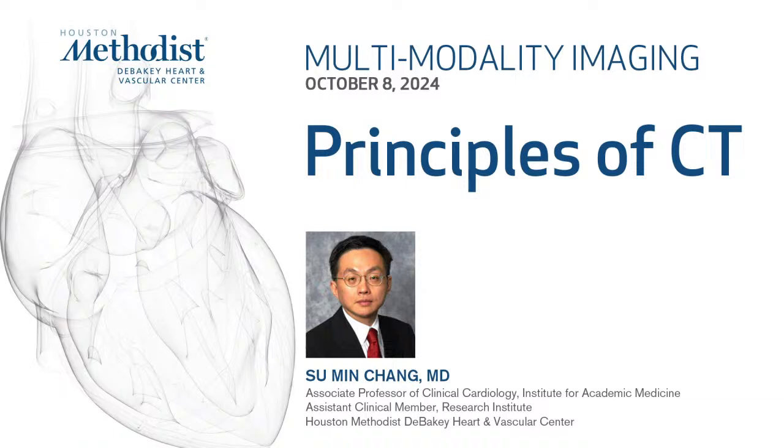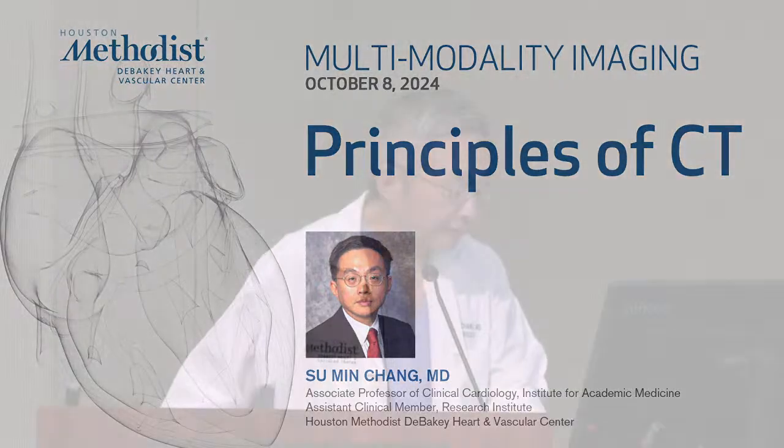Let's go through the basic principle of cardiac CT. I'm going to try to make it more clinical rather than a lot of science. You know, that's a lot of physics, but we'll try to make it clinically applicable. Okay.